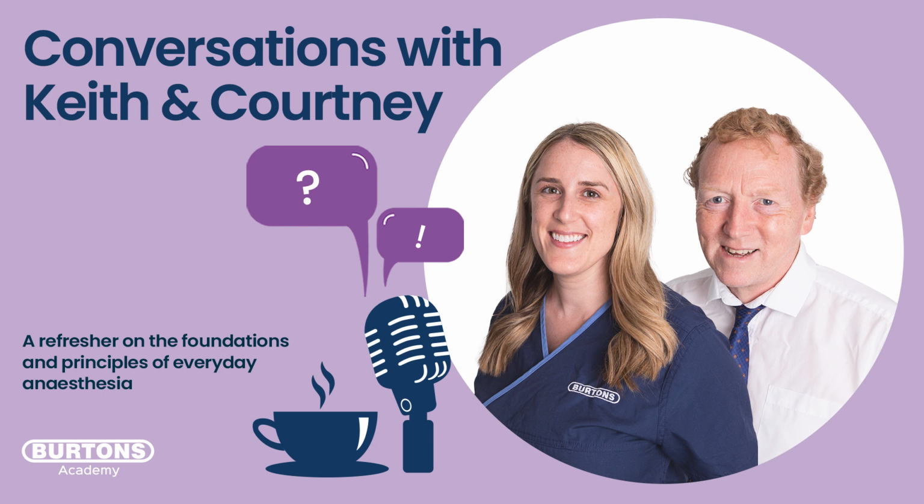And we've got a very different dynamic. Now we've abolished that thoracic pump mechanism we talked about. That's going to have an impact on cardiac output during the pressure phase. I just want to put that in context. If you've got 1 second of inspiration and 5 seconds of expiration, you're only pressurizing and compromising venous return for 1 second, and then you've got 5 seconds of relaxation. We'll come on to talk about that later, but that's the IE ratio really. If your IE ratio gets too low, like 1:1, then you're not really allowing enough time for normal blood flow to return. So that's why we get concerned about it.